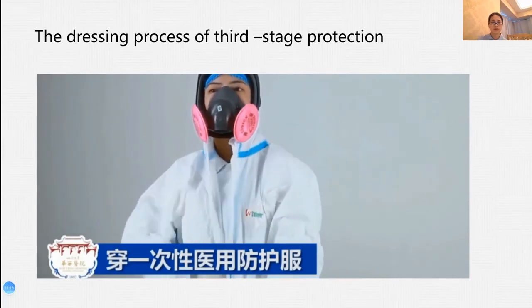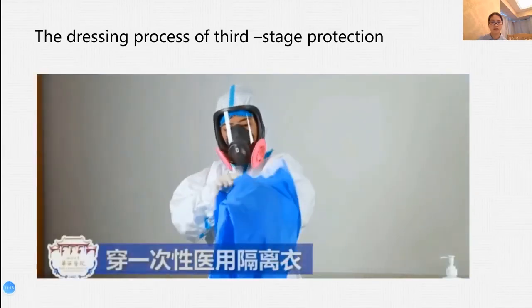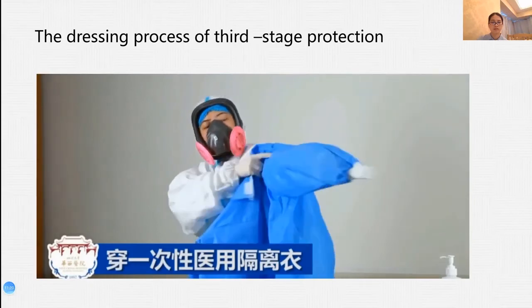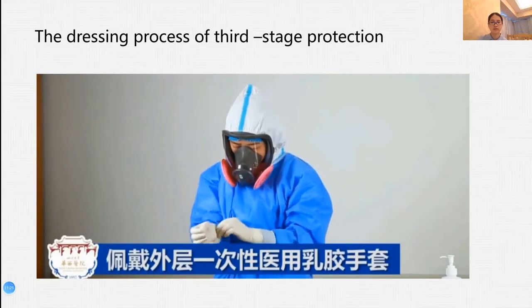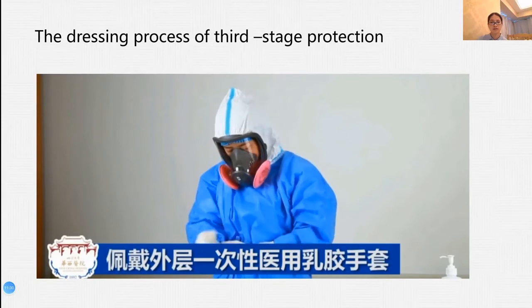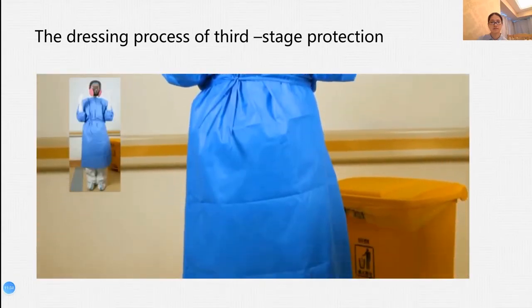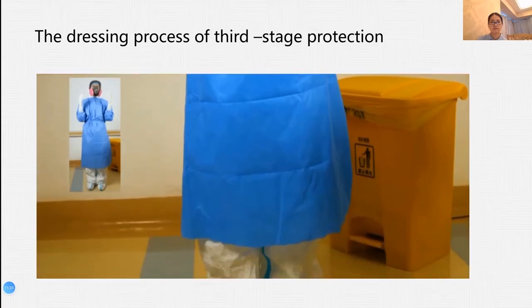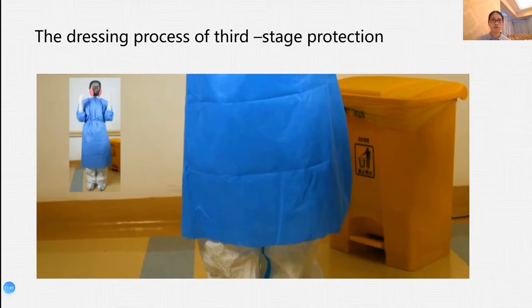Wear the disposable medical protective clothing. Wear disposable medical isolation clothing. And wear the latex gloves outside. This is the whole dressing process.